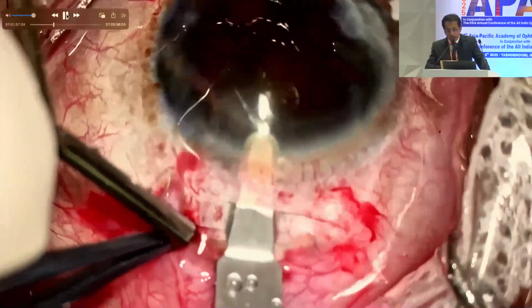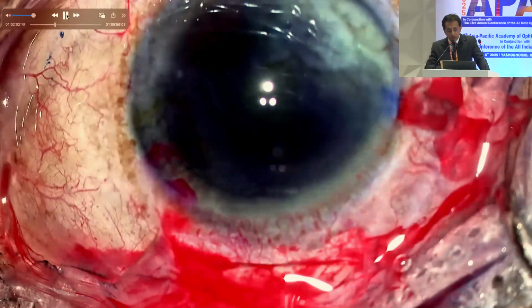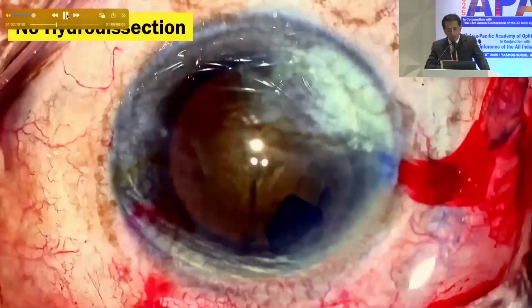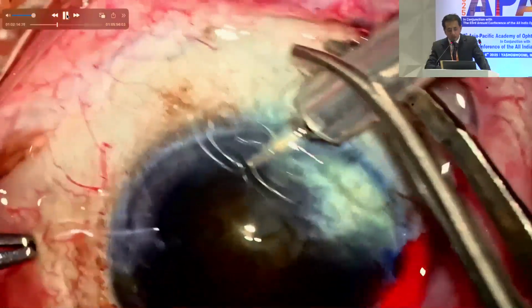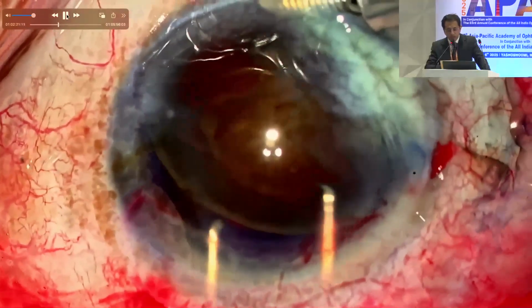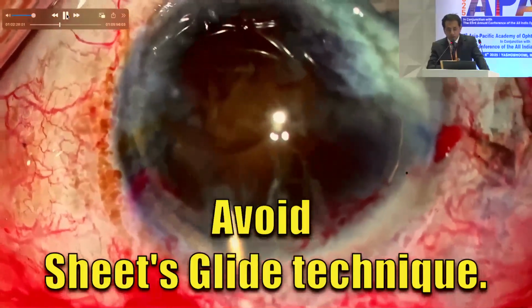We performed the same steps. You have a large oval rhexis, but one additional thing which I did in this case was, during the delivery of the nucleus, I didn't want the chamber to shallow. At that stage, I thought it's better to maintain the chamber using an AC maintainer. I'm using it of late. I've never used an AC maintainer before, but of late I find it useful at this stage. It is still off, it's not on now. But when I'm just removing the lens, that's the time when the AC maintainer is turned on.